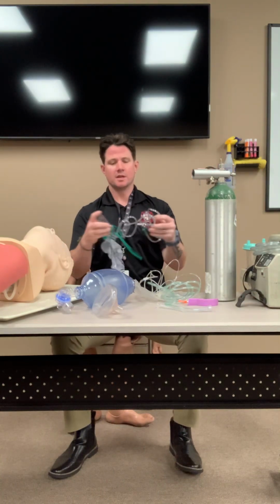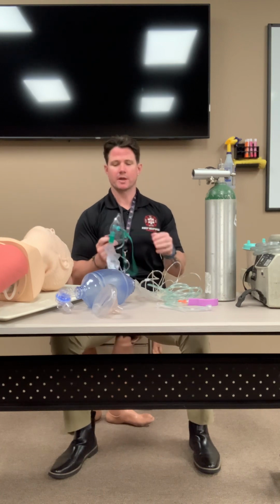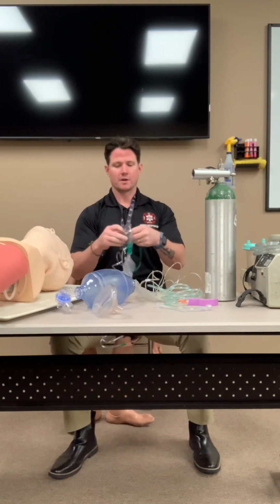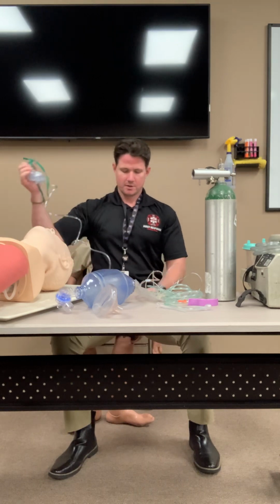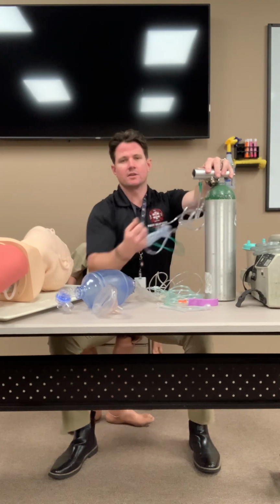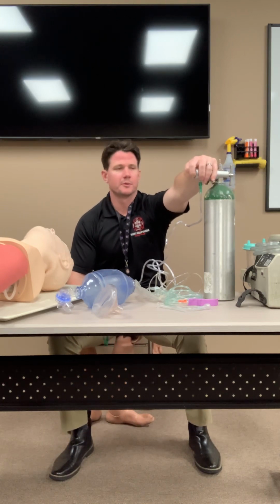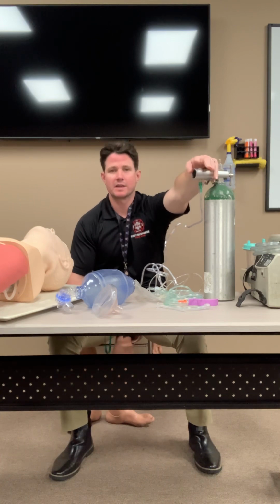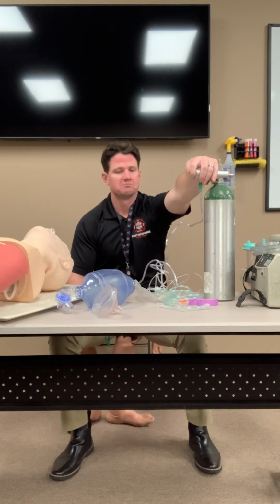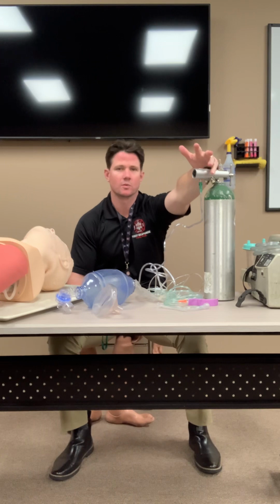All right, remember, the key is we never put a mask on a patient's face unless there's oxygen flowing through it, okay? We don't want them to feel smothered, all right? So again, we're gonna plug it into the same exact port as we did our cannula, but as I stated, when we set our oxygen, our liters per minute for the non-rebreather, we're doing it at a minimum of 15, all right? I know there's a range, but my recommendation is stick with 15. You'll never go wrong with 15. All right, you're still delivering a high concentration of oxygen either way, right?